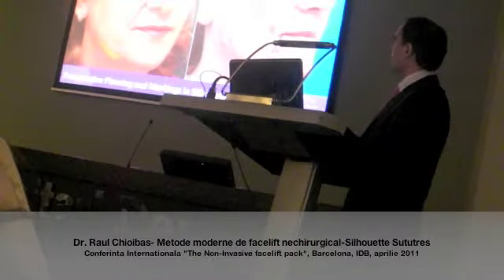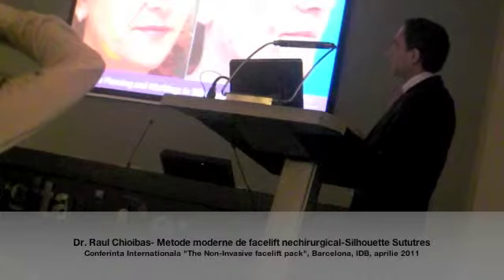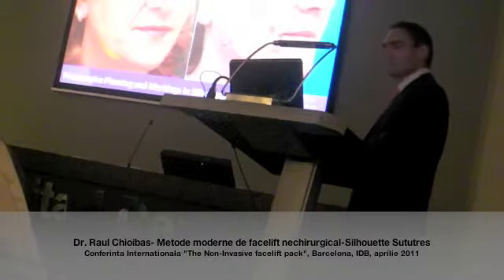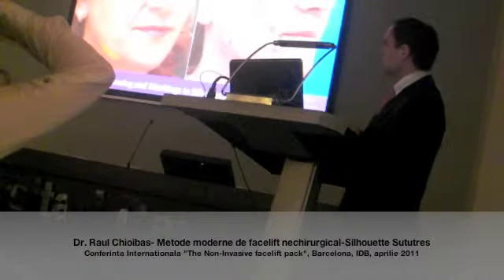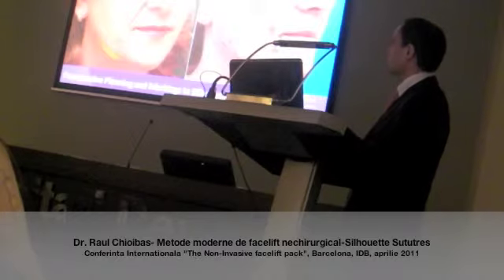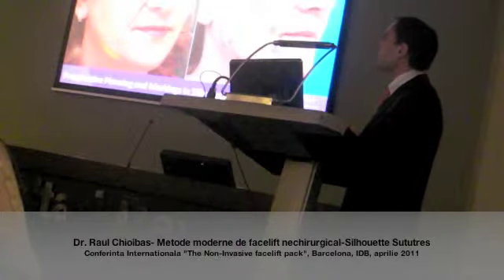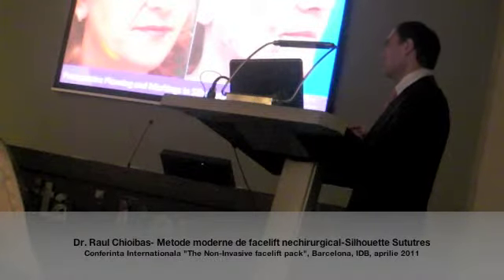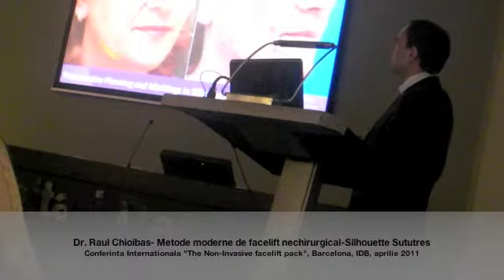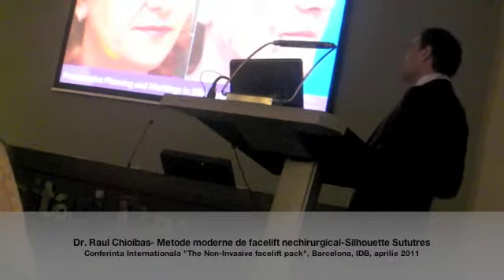Important landmarks that we usually mark on the patient before surgery are the temporal crest, the zygomatic arch, the area of passage of the frontal branch of the facial nerve, and of course the sentinel vein. These two things are very important to talk about, because in this area, as everybody knows and saw in the previous lectures, we have to pass the suture with the introducer very superficially in order not to damage either the nerve or the sentinel vein. And of course, we usually also mark the area where the parotid gland is, in order to have the last two exit points of the sutures placed in the area in front of this landmark.